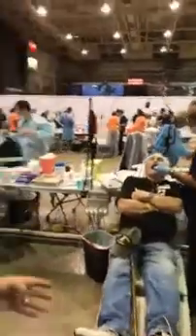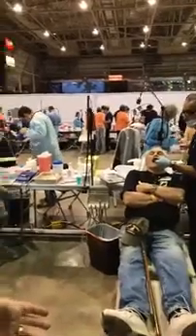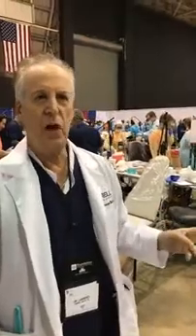Very good. Would you like to show us where a few people are in the process right now? I think we're making some initial impressions over this way. Sure, come on over here. The first step in the process is to take an impression with alginate, a model of the mouth. This is a model of the jaw with no teeth. Once that's done, it's poured up in stone, and we take it back to the laboratory where we choose the proper size denture that will be fit custom for this patient.